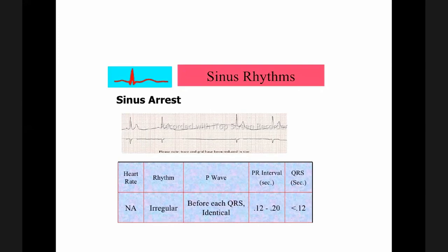The sinus node has stopped firing. So this is what we call a sinus arrest. Then after a while, this long pause here, it starts again. P, QRS, T. Here there's a small P. QRST. So here there was what? A dropped beat. Because there's even no P, it means that it's the sinus node's area. That's where the problem is. Okay. So sinus arrest.